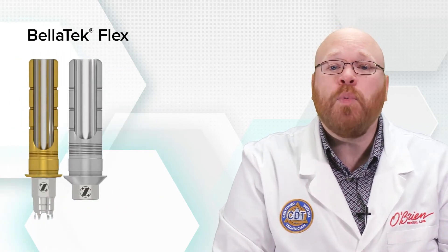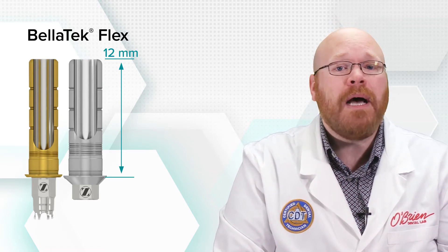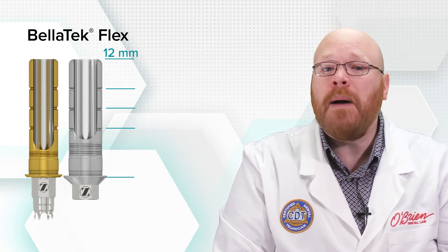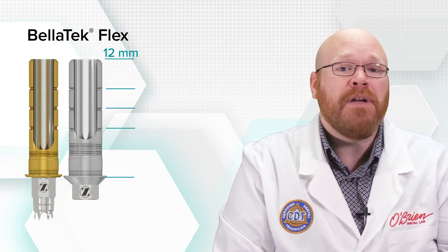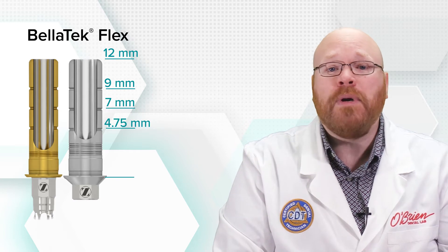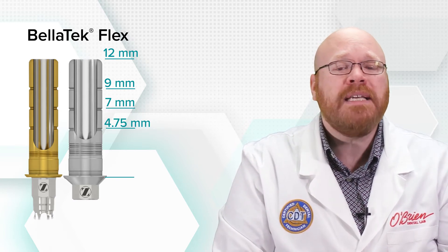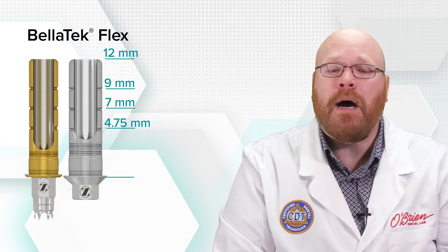The Bellatec Flex is a 12 millimeter tall abutment, which can be used as is, or it can be cut down to various heights. There are three machined grooves on the side of the abutment that indicate where to cut the abutment to achieve a height of either 9, 7, or 4.75 millimeters.